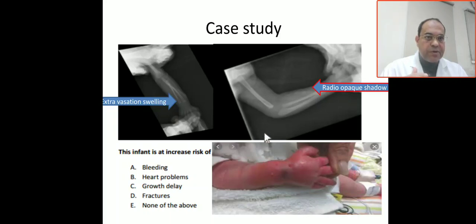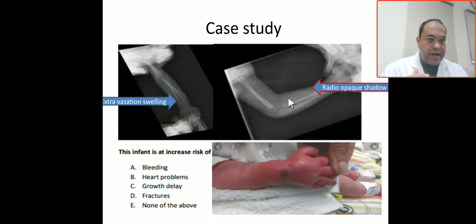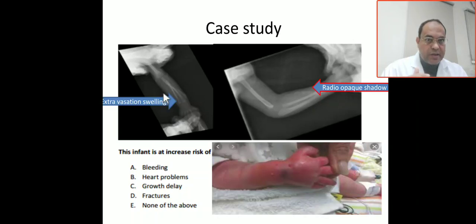Looking at the X-ray, you can see there is a radio-opaque shadow here. This radio-opaque shadow is due to calcium infiltration and soft tissue swelling. The ulnar is actually present if you see the X-ray here. This is extravasation swelling with calcium infiltrations.